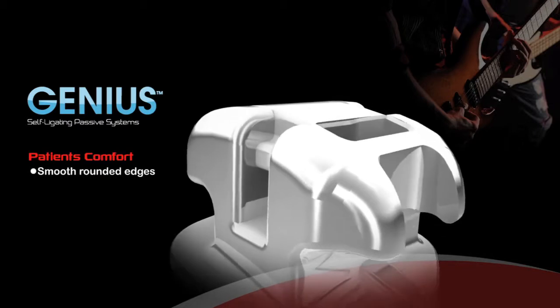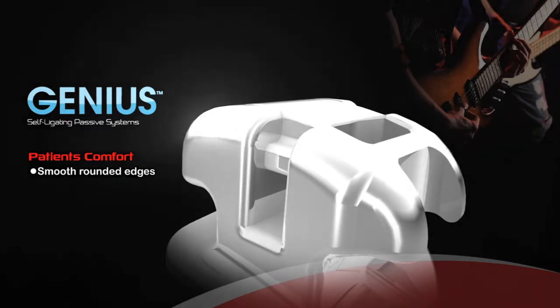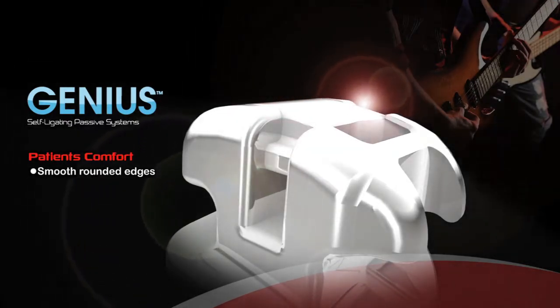Patient Comfort: Genius is designed with rounded edges to provide patient comfort.